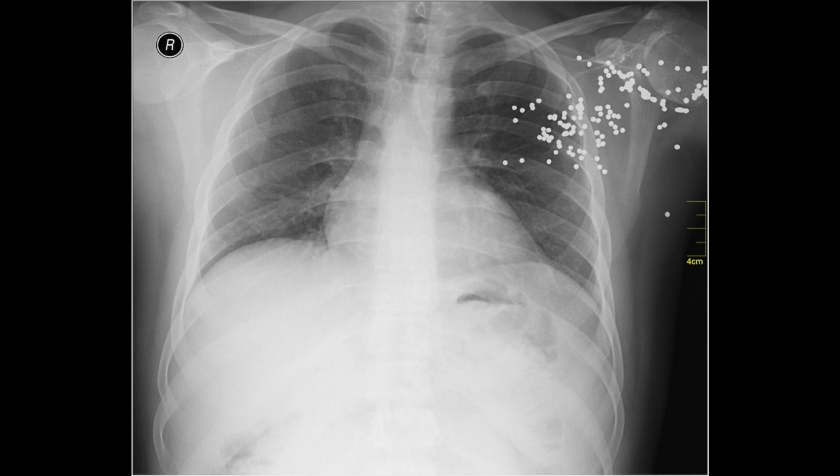So I've gone over how X-ray images are made and how X radiation is generated. Now I'm going to talk about how X-rays are used in clinical settings. X-rays aren't good at creating images of soft tissue, such as tendons or ligaments, because they don't absorb the X-rays. So X-rays are generally not used to detect sprains, which is damage to a ligament, or something like muscular injury.